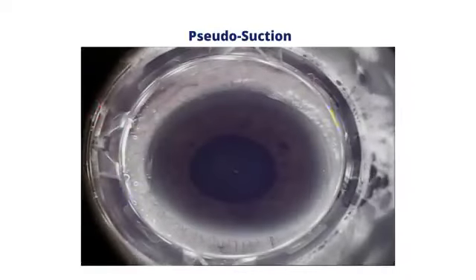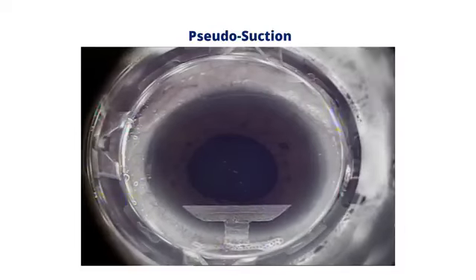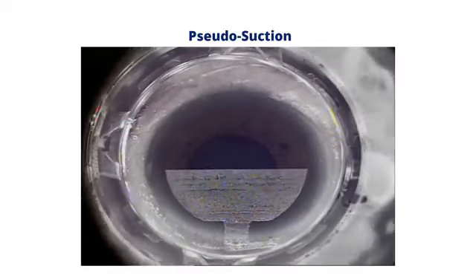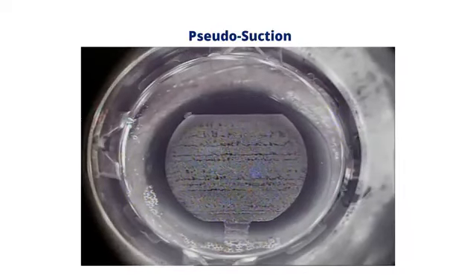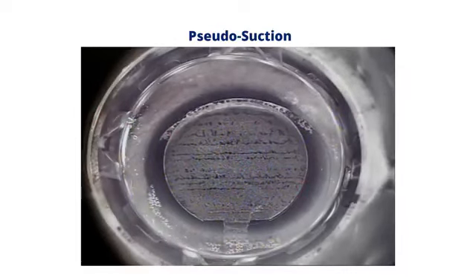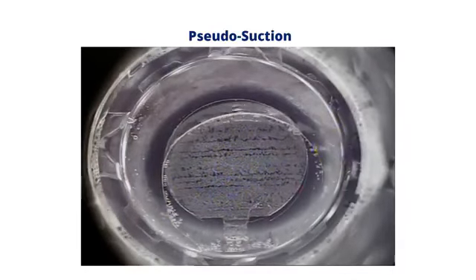This video shows conjunctival chemosis that happens at the beginning. There is fluid accumulation in the limbal area, but the surgeon did not stop and resuction, resulting in pseudosuction and a shallow-cut, thin flap. Actually, it can be prevented by squeezing the loose conjunctiva outside the suction ring with a dry sponge before suction up.